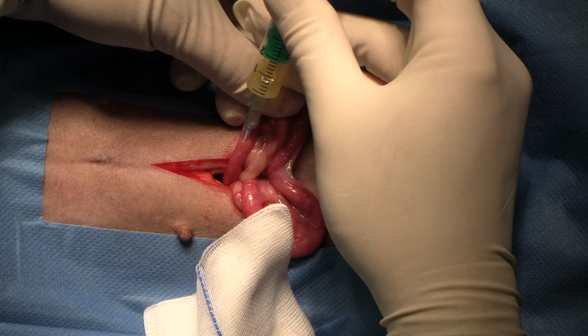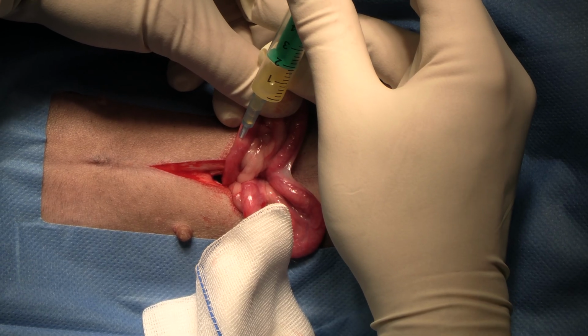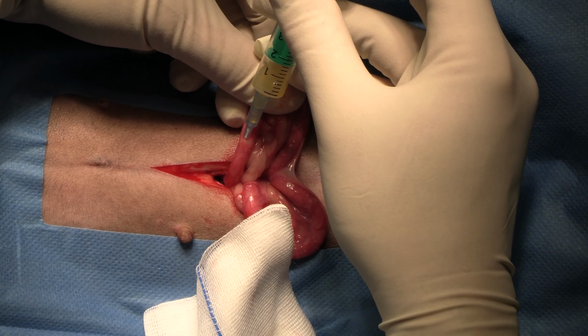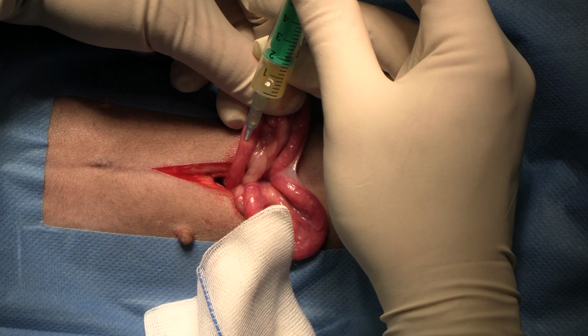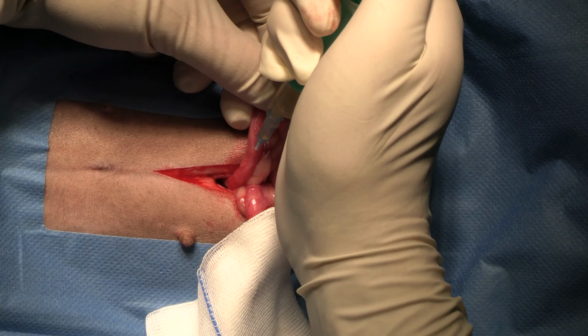This is the way that I was taught. I know that some individuals will do a single catheter in the uterine body. I'm sure that's a very valid method. Just not what I was taught. So I can feel that uterus ballooning and I can feel it hitting my finger back here. So I'm 100% confident that the semen is going where it needs to go.